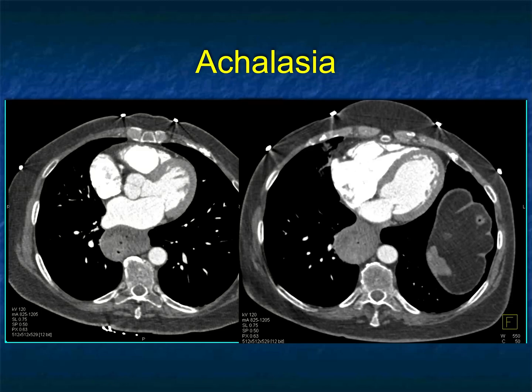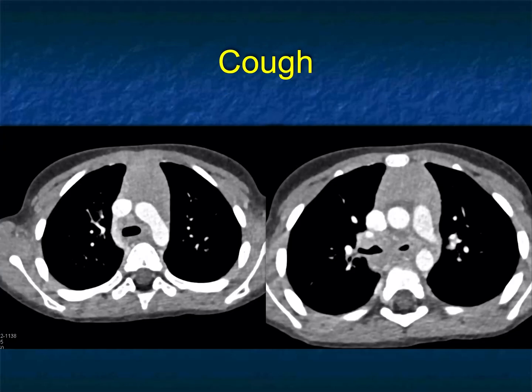Achalasia. Achalasia: dilated esophagus, lots of food and fluid. Often achalasia presents with aspiration, can present with pneumonia, can present with an underlying tumor. Sometimes it presents with chest pain, and in this case it presents as if the patient might be having a dissection — an important differential point.